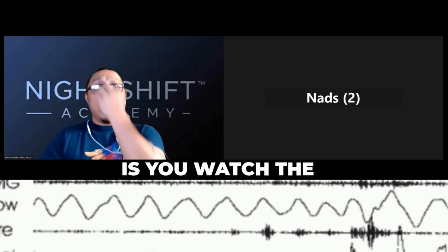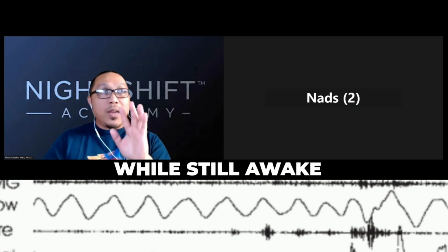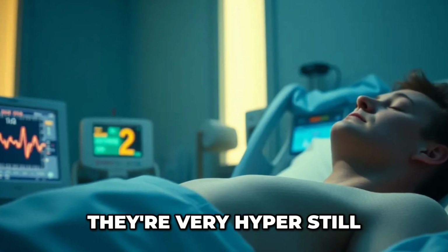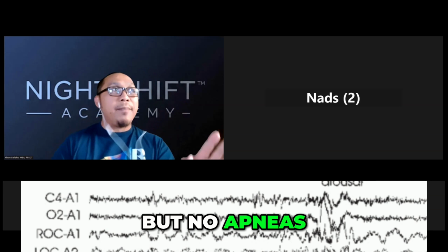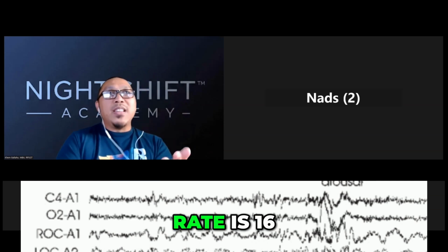What you do is you watch the patient on a device while still awake but resting, right? Don't count the rate of that patient when they're very hyper still. Wait until they're resting. Meaning to say, you might see alpha attenuation, but no apneas. Count the rate there. It's the resting rate.